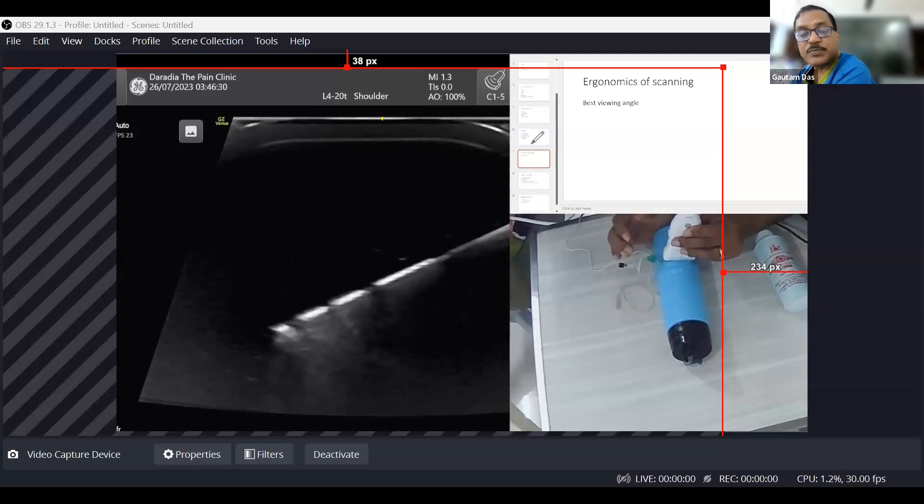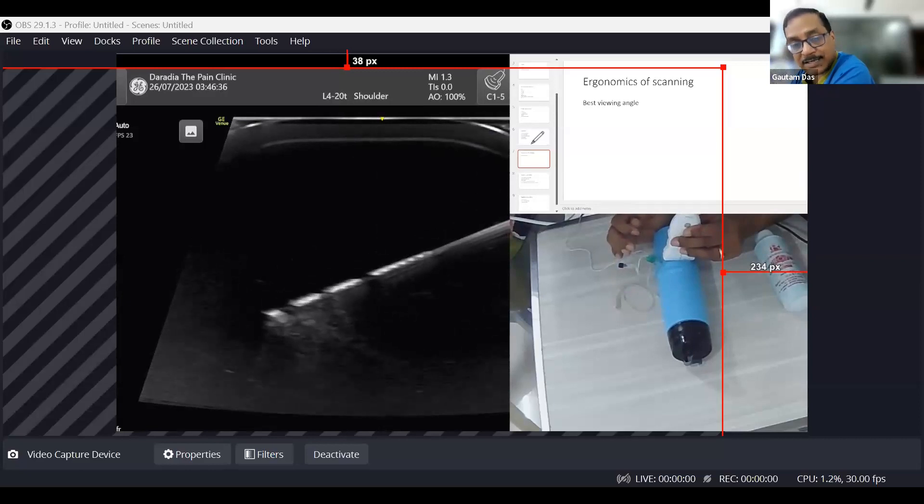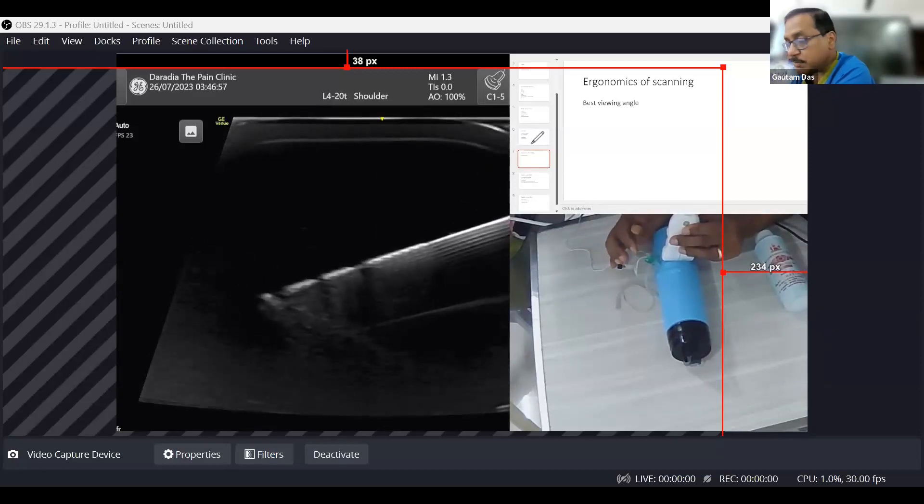So there are three techniques so far: first, try to keep the angle less than 30 degrees — almost horizontal is best. Second, make a fine needle movement so that surrounding structures move, allowing you to understand the needle trajectory. Third, use an ultrasound-specific needle for better visibility, though it is sometimes costlier and increases procedure cost.